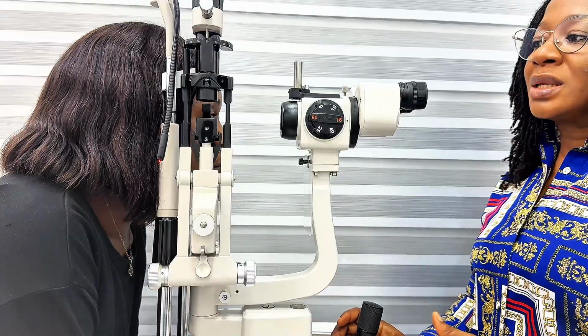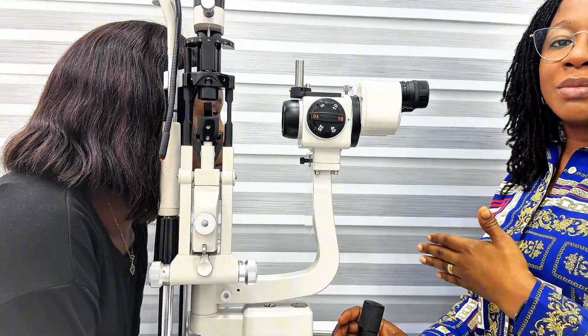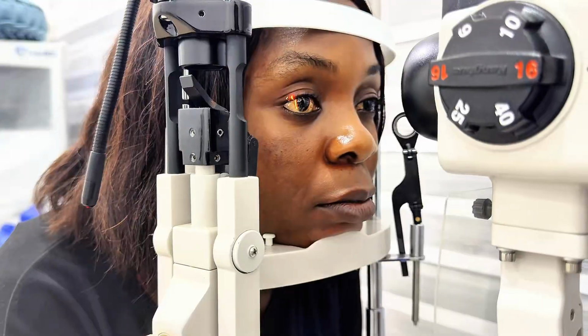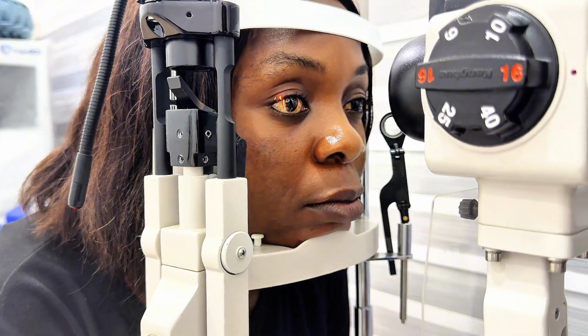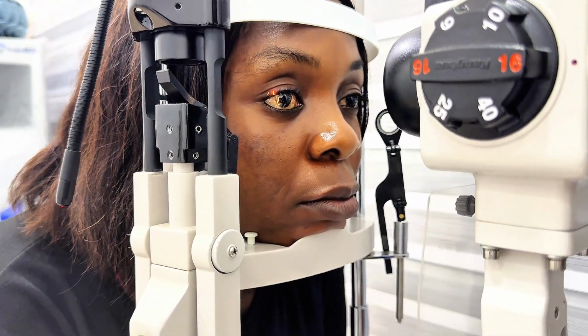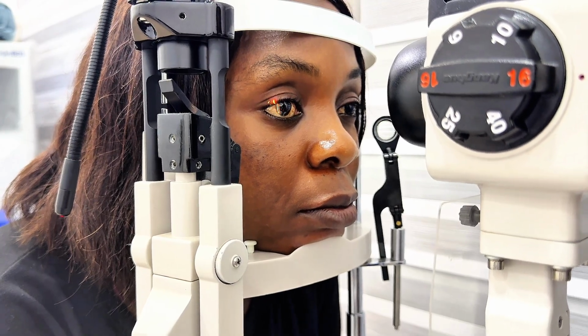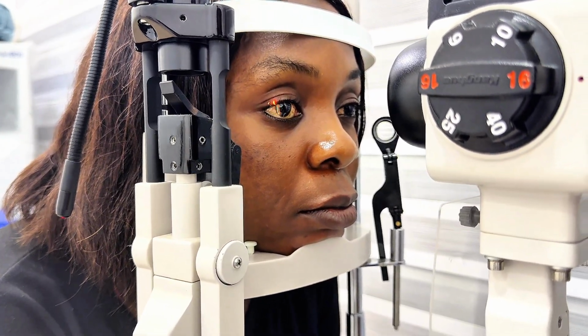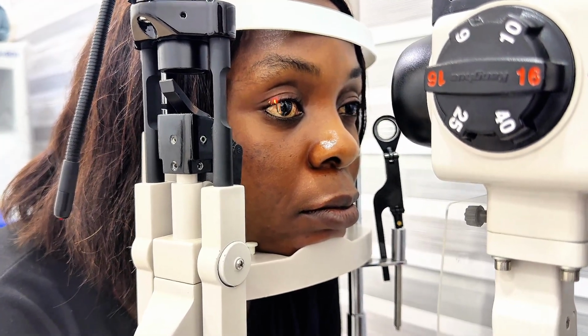For the Herick technique, you measure from the temporal limbus and you also measure from the nasal limbus. Then you judge the depth of your patient's anterior chamber by comparing the space in between the endothelium of the cornea and the light being reflected from the iris. You are comparing the thickness of that space with the thickness of the cornea.